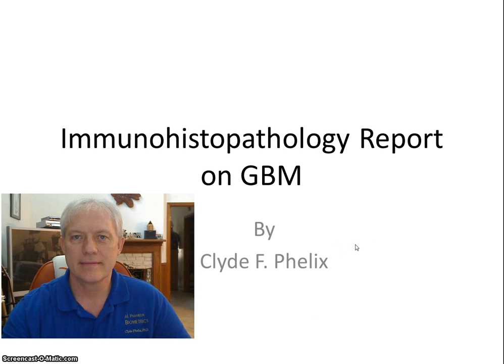In this video, I'd like to be the first in a series. I'd like to begin to consider the immunohistopathology on the glioblastoma specimens that were sent to me.